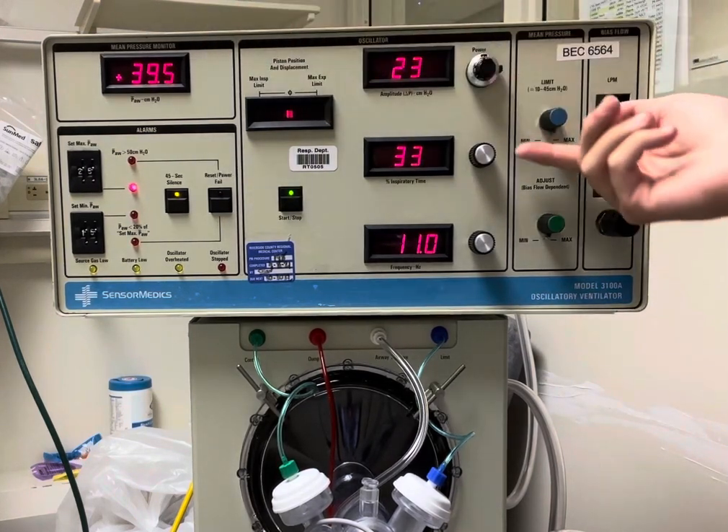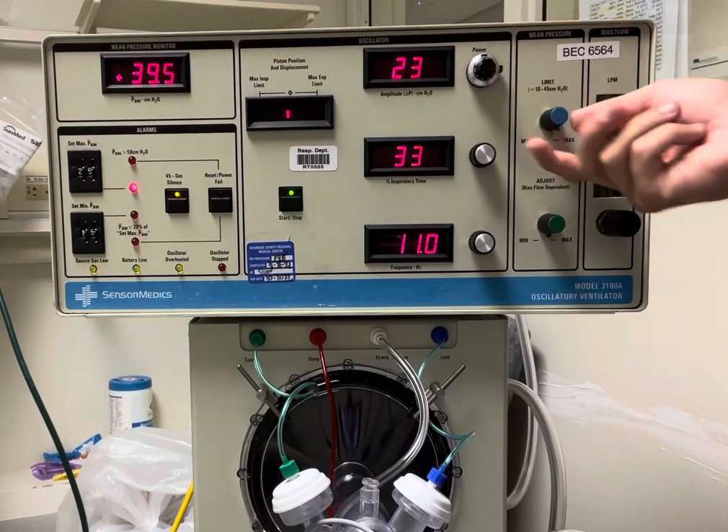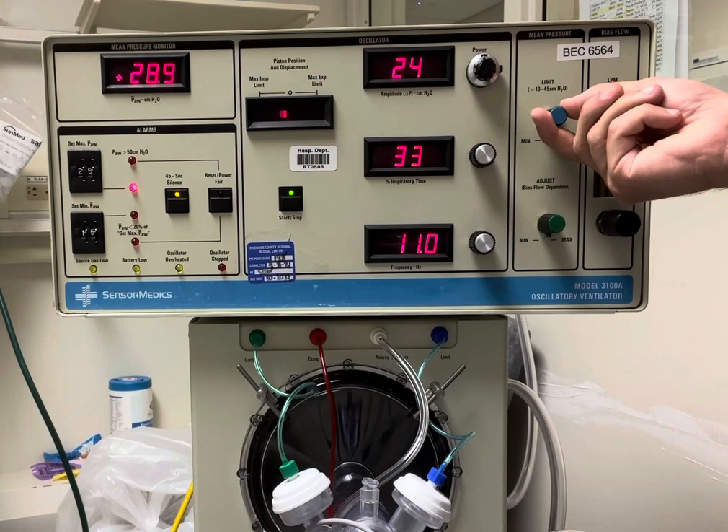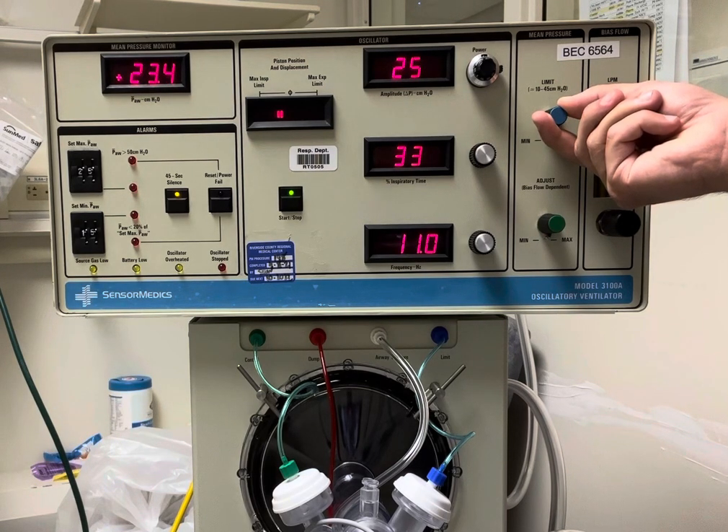Now for my mean pressure — let's say we want it at 20. I'm going to go ahead and turn this knob down until my mean gets to about 20.